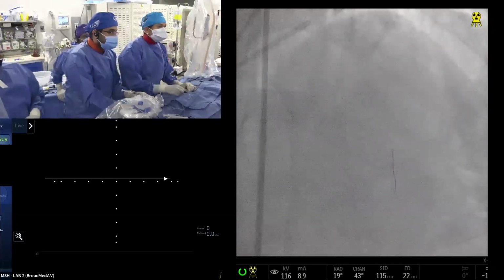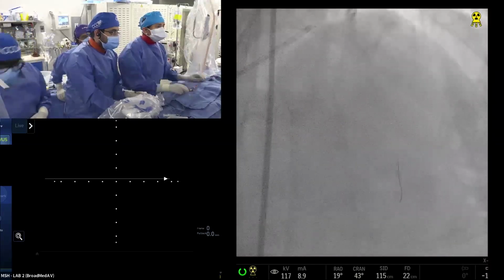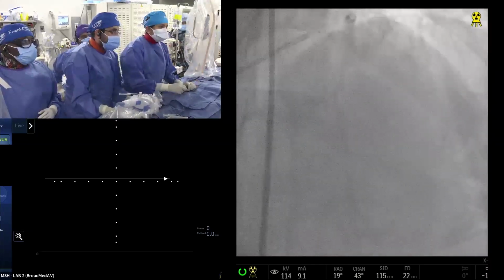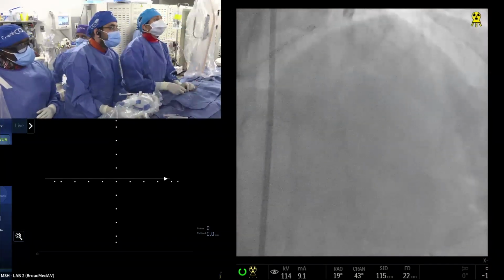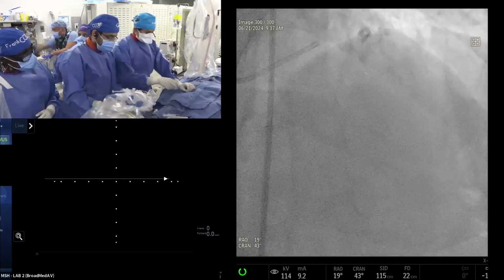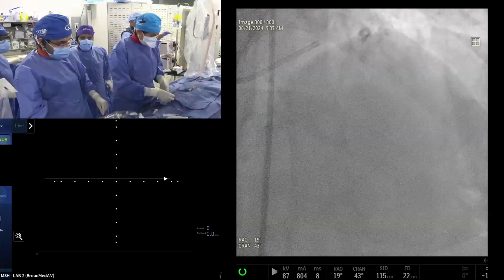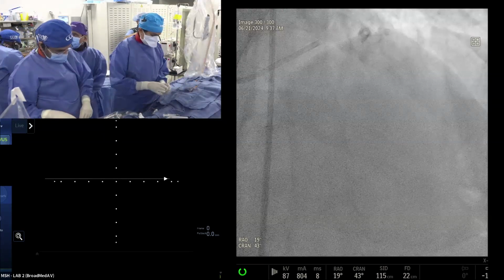Okay. Fascinating strategy, Dr. Samin. Just two small queries. Number one, is Agent approved for de novo lesions or just for ISR? ISR. By definition it is approved for that, but remember we have used it in many de novo cases now. Although the price has been an issue, it is very expensive. They made it $5,000, and there is no corresponding reimbursement yet. Same stent, same cutting balloon, same drug-coated balloon, you have it at $400, $800, equivalent. Here it is $5,000. Yes, the reimbursement may come up and then it will compensate for it. But right now it's a loss to the institution.